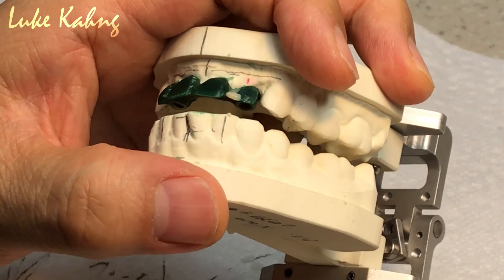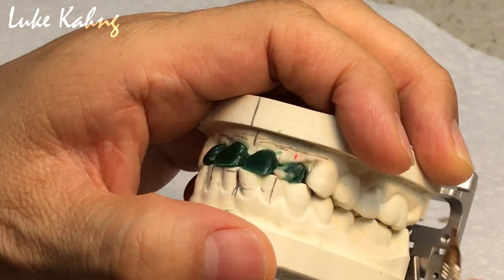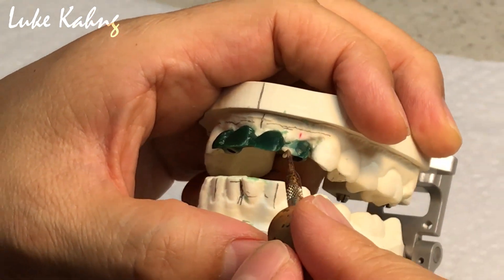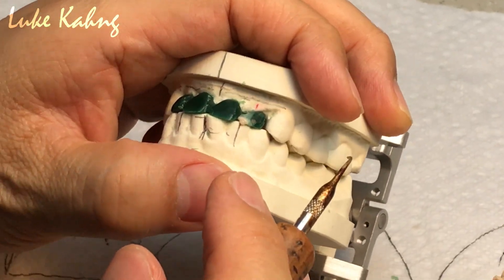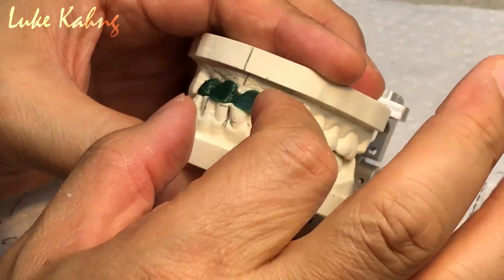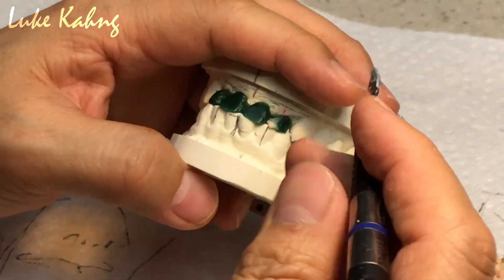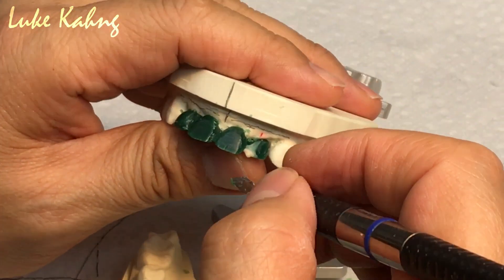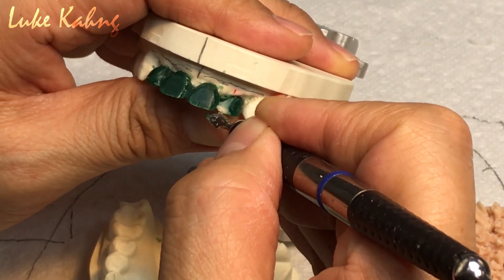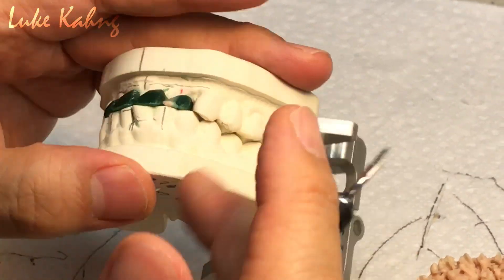I'm going to grind later, I have to cool down. I need a little bit more. So not only midline — size, and then horizontal line, because central is longer than lateral. So I do not like here. Cut it — that's good. Now this one little bit cut it. This is a finer — now it's a little bit fat, so I cut it a little bit.